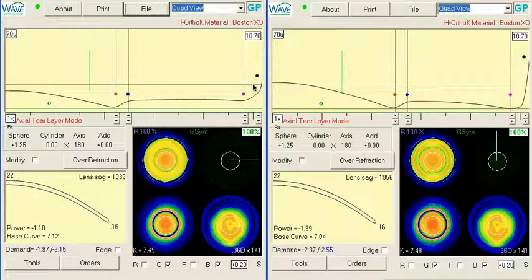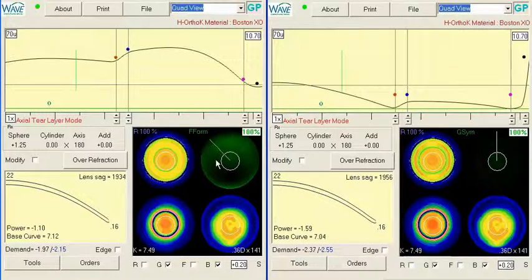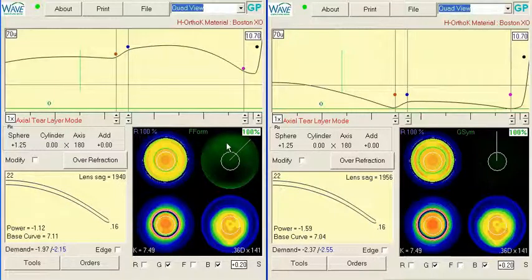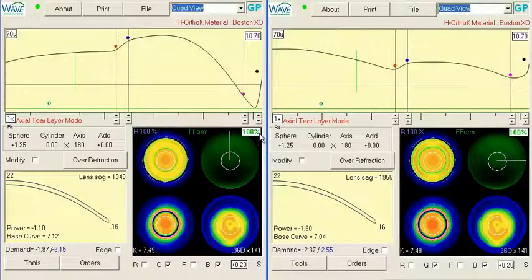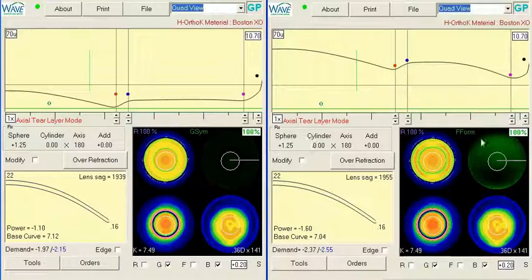And then incidentally, now that we have Wave 8.1, if we go to the freeform design, we can also see that maybe this lens isn't fitting as well as we want it to. Again, I'm kind of new to Wave 8.1, and so I'm not totally sure that this is a very accurate representation. Could be some artifact in there, but if we go by the visuals, this lens really isn't fitting the way that we kind of want it to in a G-SIM.